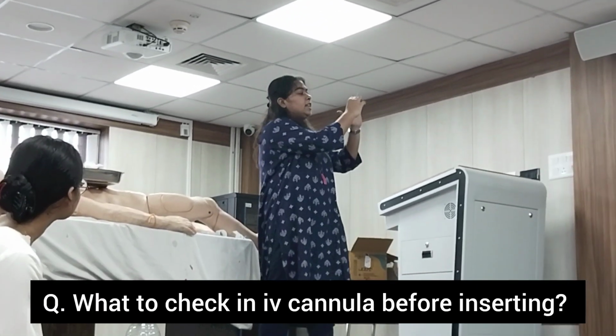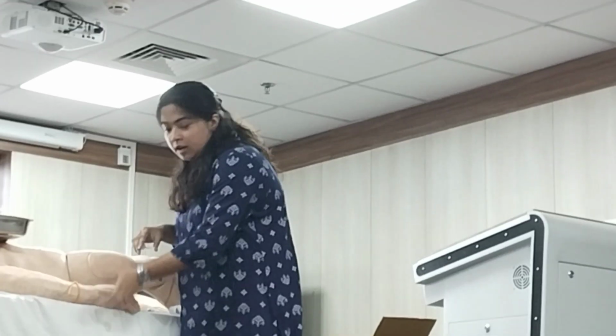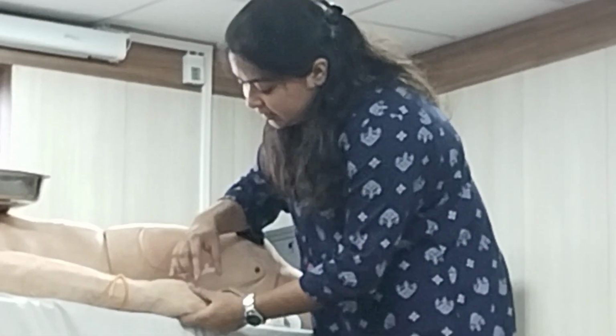So here also take the support of the wings, put your four fingers over there. You will have the bevel end upwards. You will ask the patient to clench his fist, so that the prominence of the vein is there.